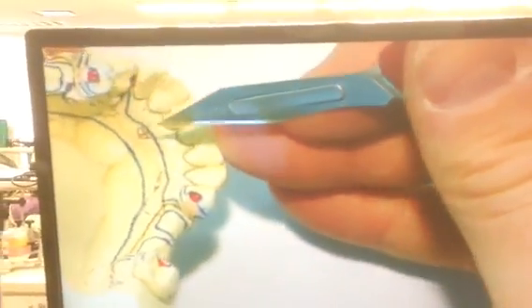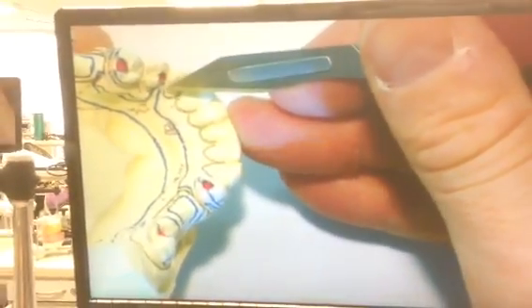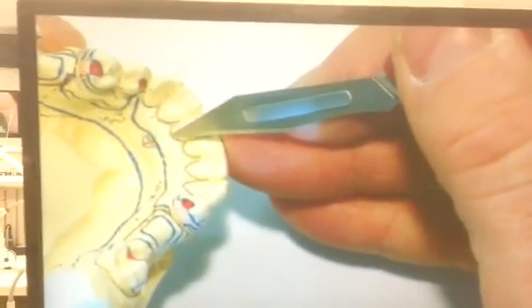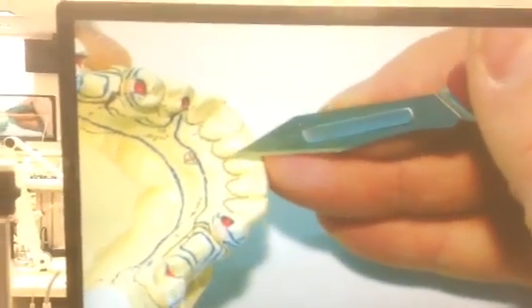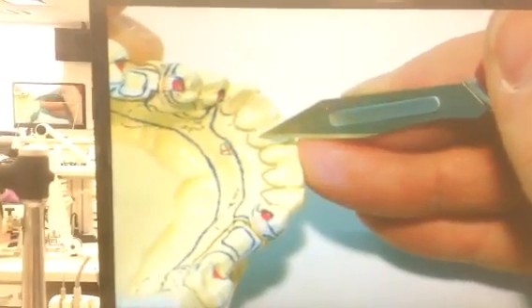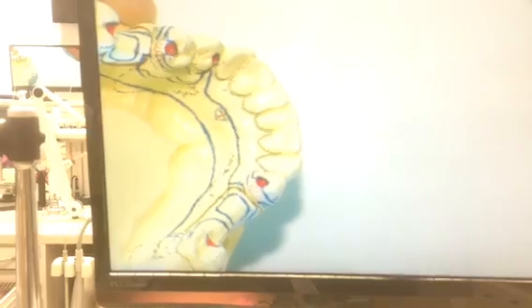The key to doing that lingual plate, by the way, the only other place that I've seen students marked off for doing the lingual plate is if they didn't mark the survey line on the lingual of these teeth. Okay? If you're going to do a lingual plate, you need to demonstrate where the height of contour is on the lingual, because you need to show that your plate is above it.